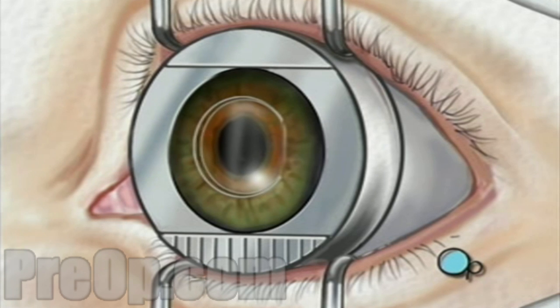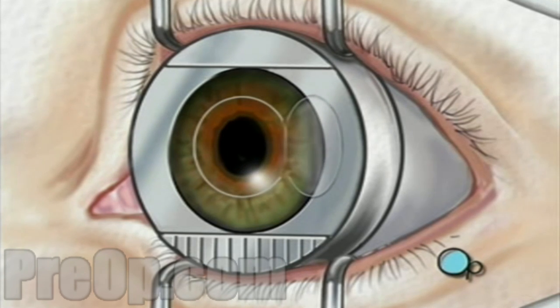Underneath this flap, the inner layer of the cornea, called the stroma, is exposed.